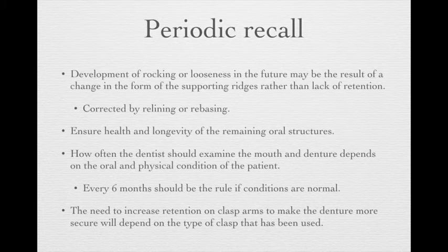Patients need to be notified that after they lose the tooth, the remaining available ridge will keep resorbing. So the fitness of the RPD framework and the base to the tooth and the ridge may change in the future. If that really happens, you have to do a reline or rebase to recreate the fitness from the denture base to the residual ridge.